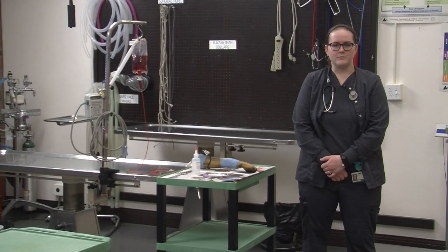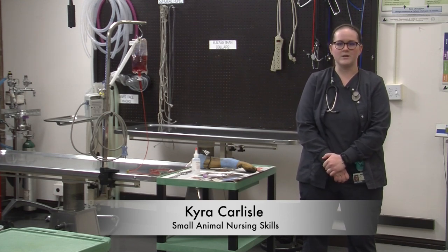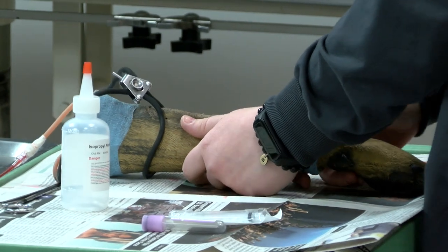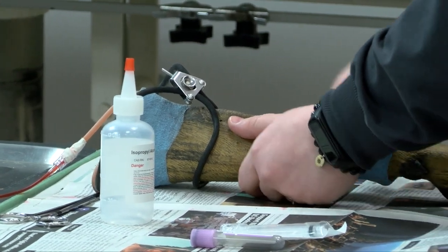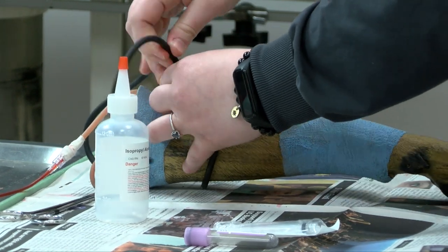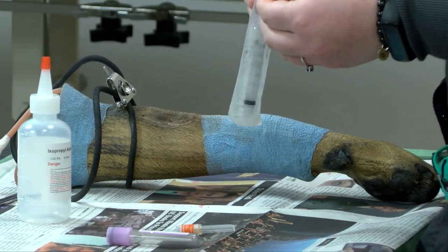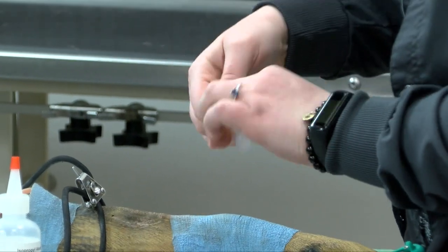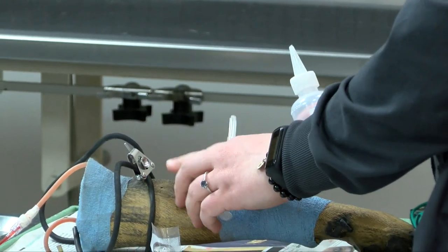This is our main lab here at Parkland for the Vet Tech program. This is where we learn our small animal nursing skills such as drawing blood, doing physical exams, and learning how to prepare for and assist with surgery. I'm going to show you how to practice drawing blood on a dog. I've got my fake leg here that we use before we learn on a real patient. The first thing I'm going to do when getting ready to draw blood is tighten this tourniquet, which allows the vein to be held off so that I can get blood from it. Then I'm going to open my needle and syringe, which is what I'll use to actually collect the blood.